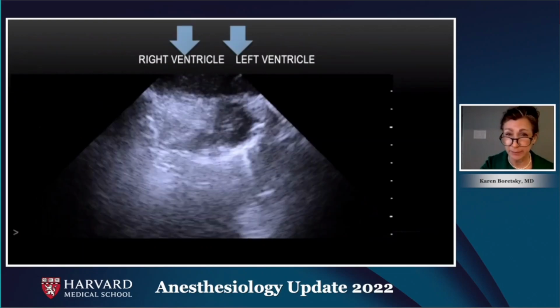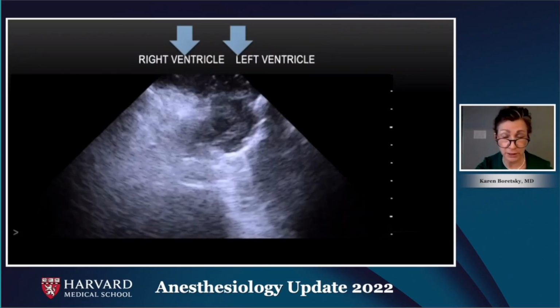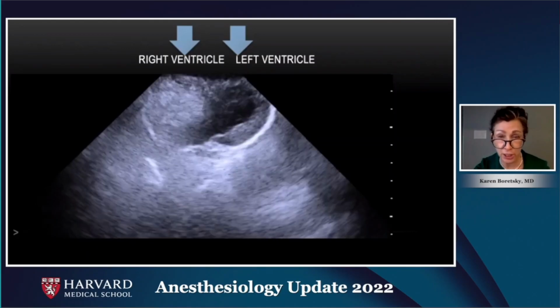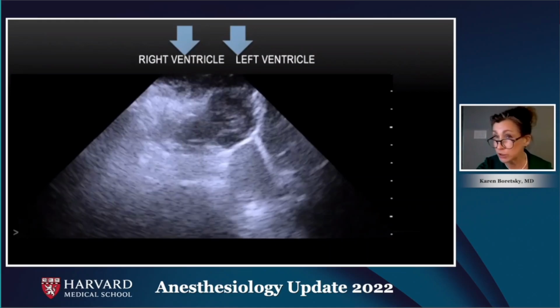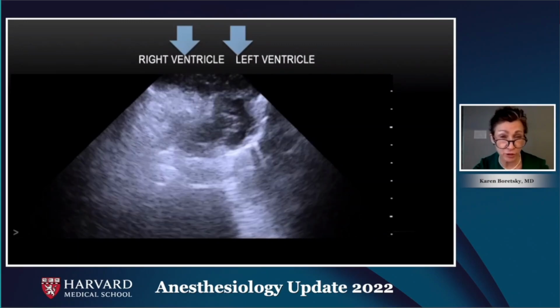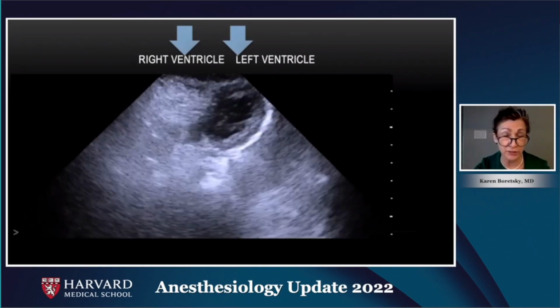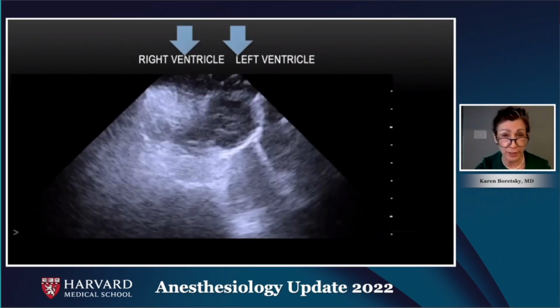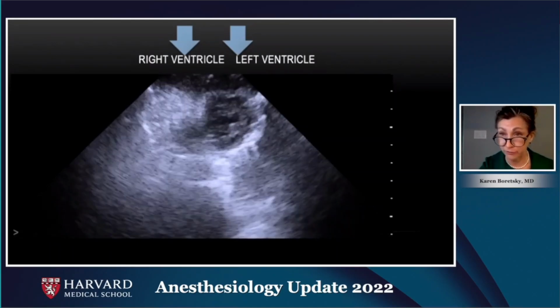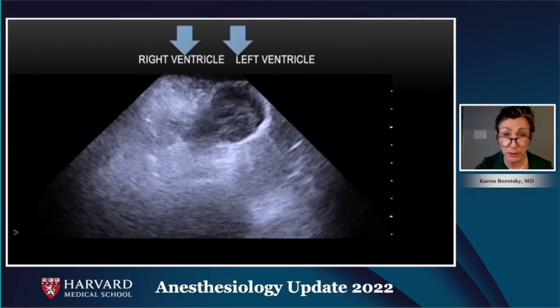We did a report. This is a 15-month-old toddler coming in for open reduction internal fixation of hip dysplasia. This patient was categorized as an ASA 1 patient. After the induction of anesthesia, while the surgeon was prepping, the patient developed hypotension, bradycardia, hypocarbia, all factors indicating imminent or actual cardiac arrest in this patient.